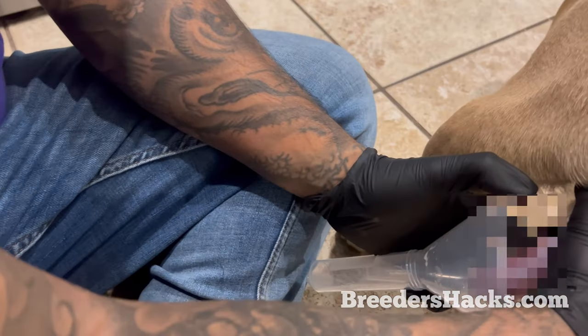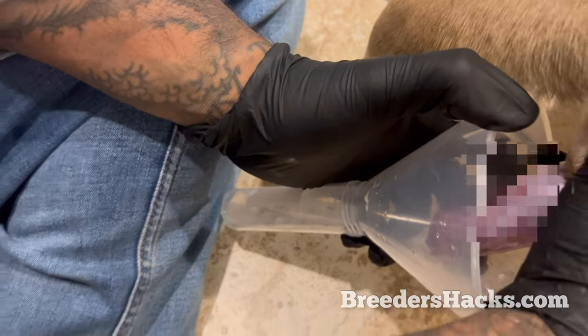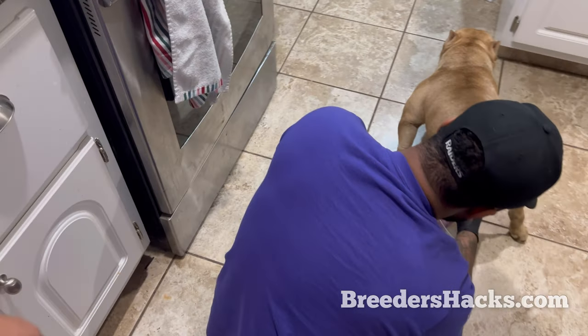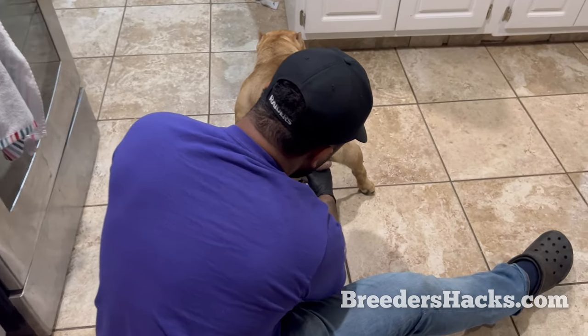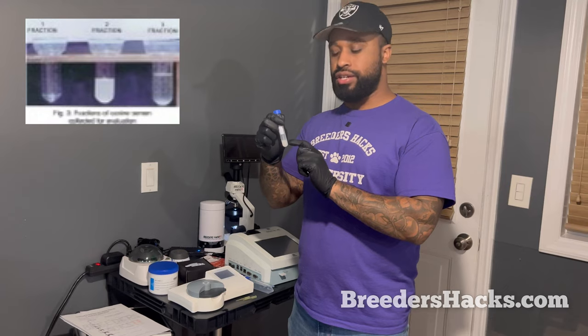I'm going to speed through it real fast because I have plenty of episodes on how to collect from a stud dog, but we really just want to show you guys how to do a proper semen evaluation. So we're just going to run through that real quick and then show you how to use the photometer and a little bit with the microscope. All right, Bully Fam, so we went ahead and did our collection, right? As you can hear, he's still going. But we only collect the sperm-rich fraction, the cloudy stuff.